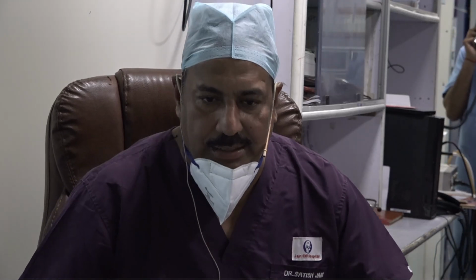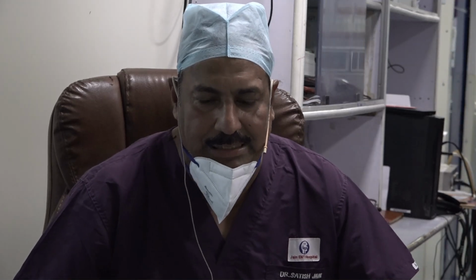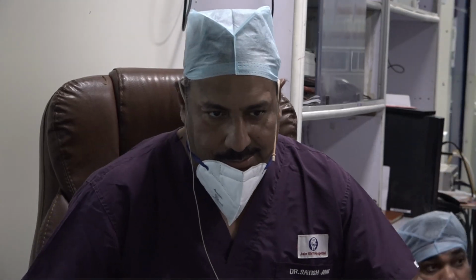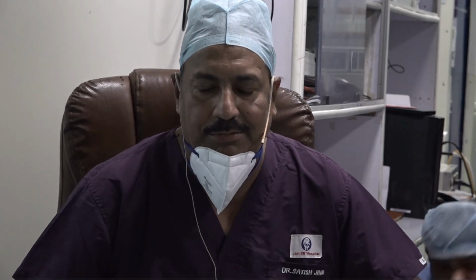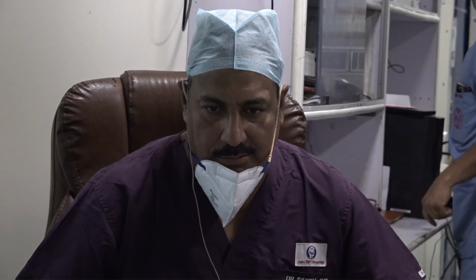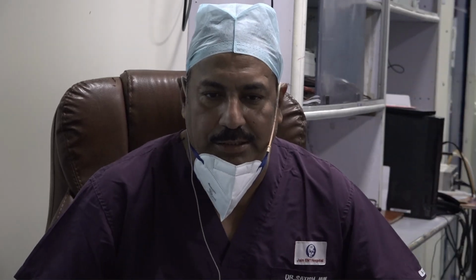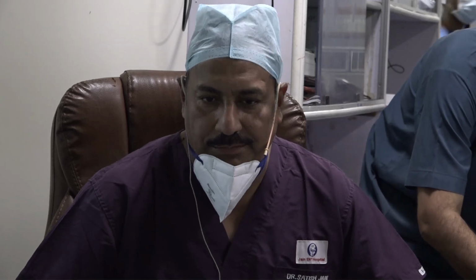So to begin with, a basic scenario, tympanoplasty. We all know we have been doing tympanoplasty. I think everybody attending has been doing tympanoplasty for long, and we all know tympanoplasty has excitingly good results, but still not 100%. Like in any surgery, we can't achieve 100%, and we are striving more and more to achieve that. And this happens to be the most common surgery in otolaryngology, wherein clinically we get a perforation. It looks so simple every time when you look at the perforation, and it makes us repair it mechanically. And many a time, in spite of the best effort, it doesn't work, and ultimately, unfortunately, we may have to see a failure.